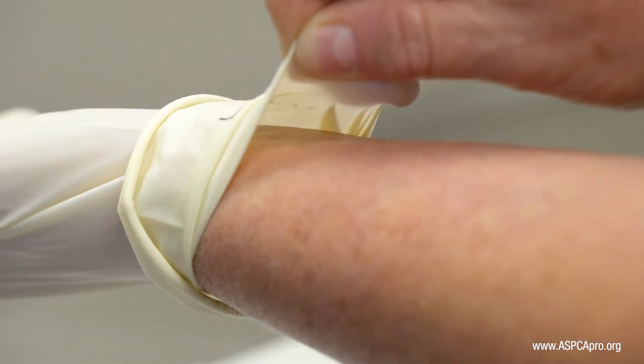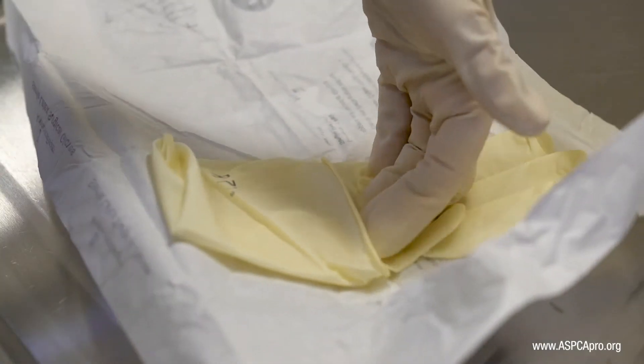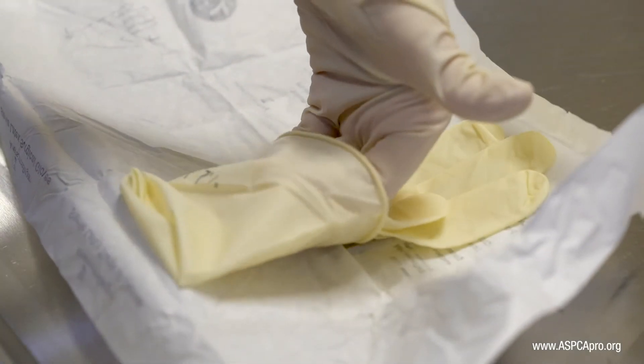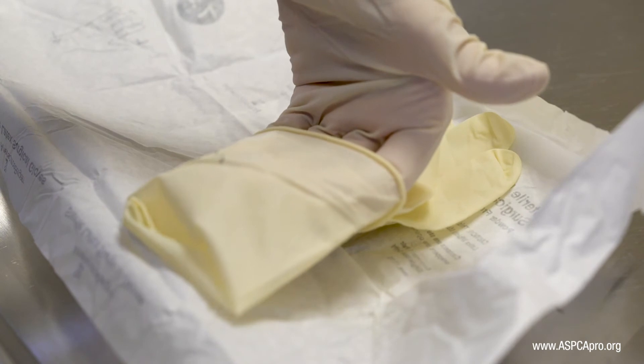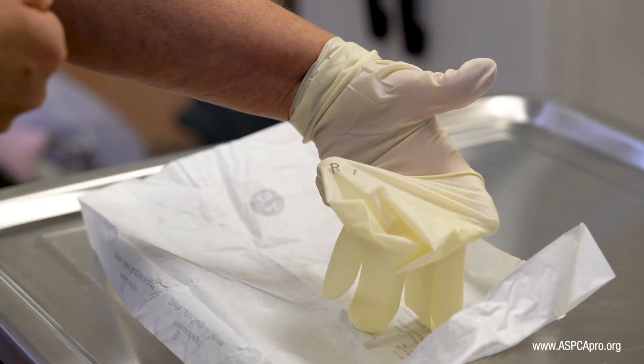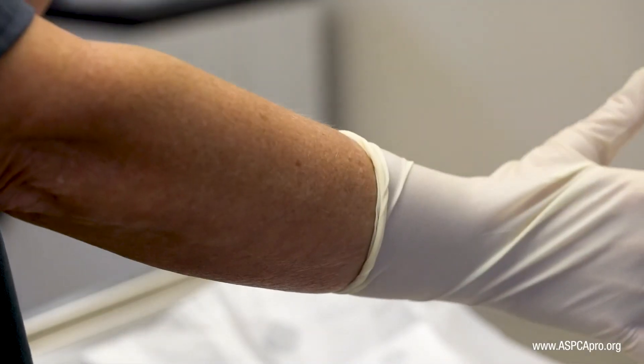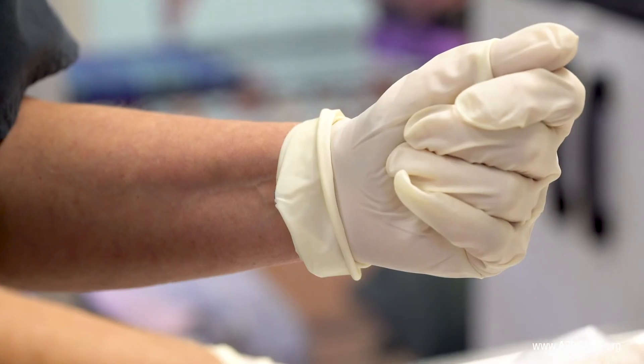Once the glove is on, drop the cuff onto your wrist. Next, use your now gloved hand to grasp the remaining glove at the sterile portion or inside aspect of the fold. Spread the cuff widely with your fingers and pull the glove all the way down your arm, then drop it to ensure your arm is not accidentally touched.